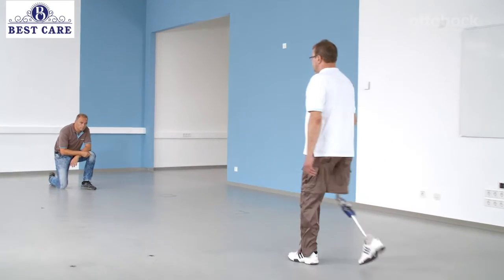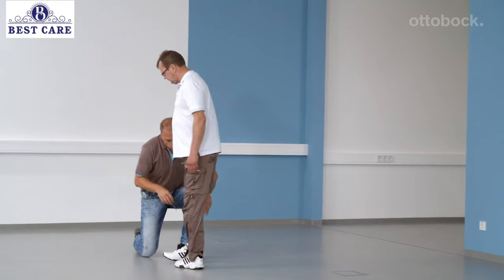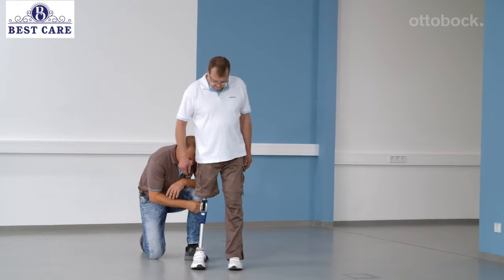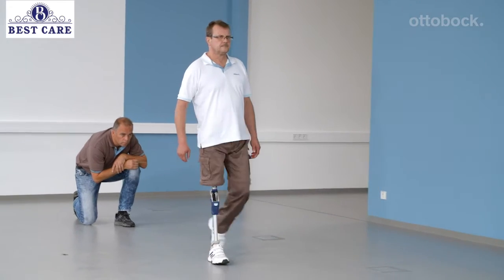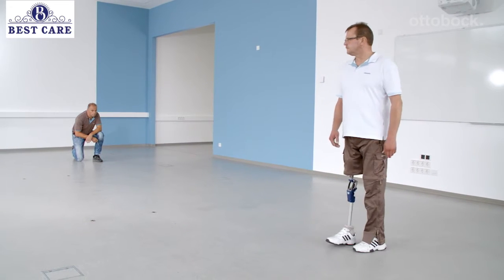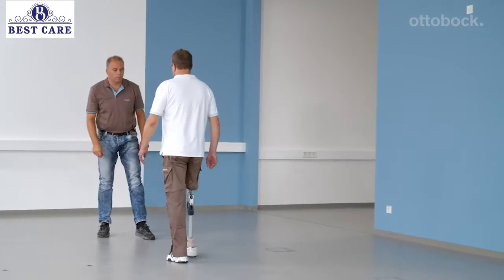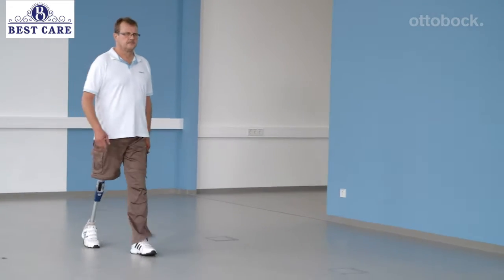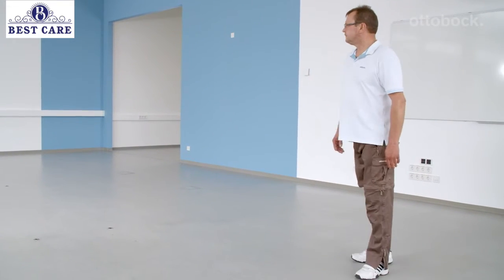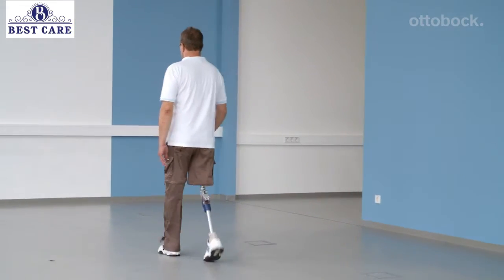At this point, the last check of the dynamic fitting is ensured. The knee axis friction is tightened a little bit so that the extension stop is softer. Now the knee is set optimally for the user, and further walking exercises can be completed.